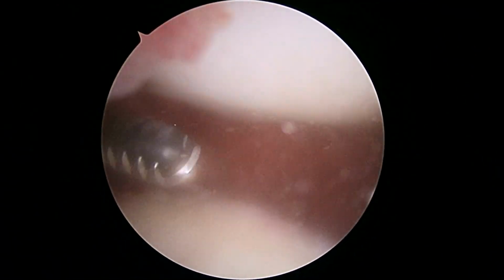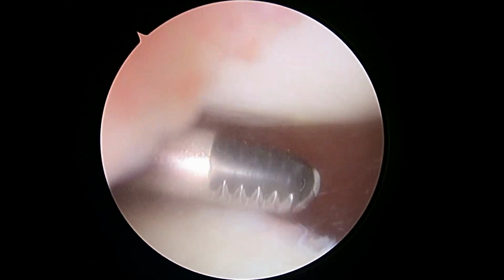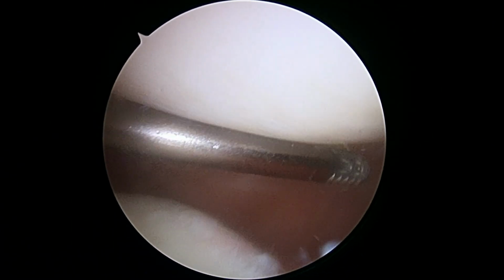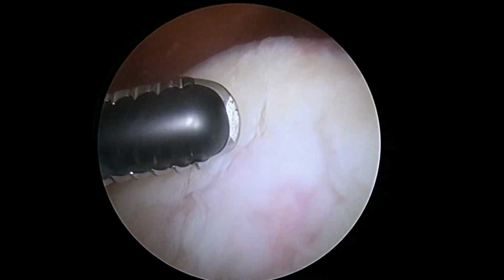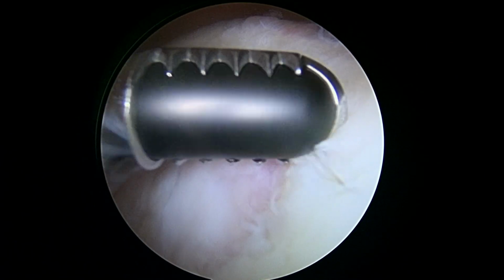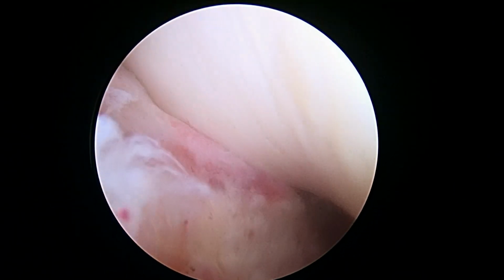Can you keep roll the knee like that? Okay, so we're just looking in the patellofemoral joint, and you've got a fair amount of arthritic change here as well. Let me show you. Here's the trochlea down below. You can see the irregularity in the cartilage layer here. It's right in the central trochlea. This is where the kneecap or the patella glides. We can track this all the way down to the front of the knee right there.